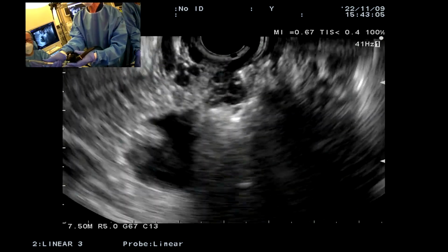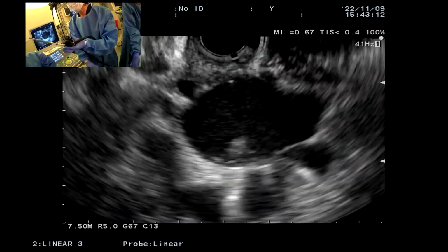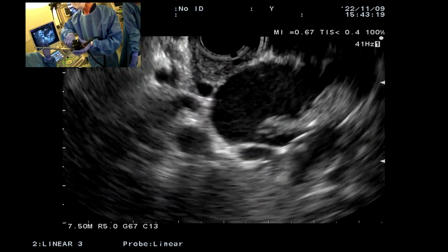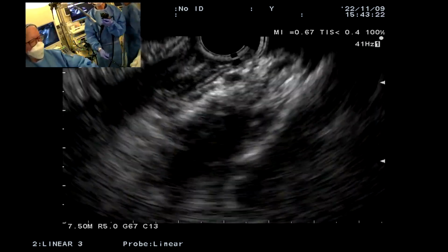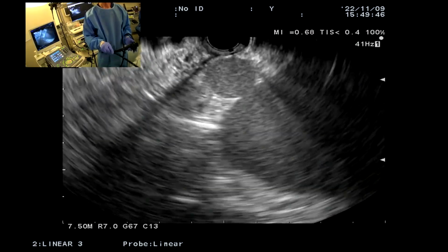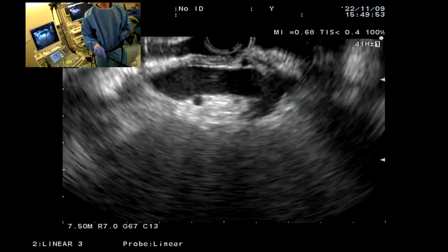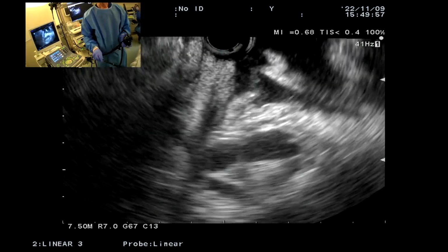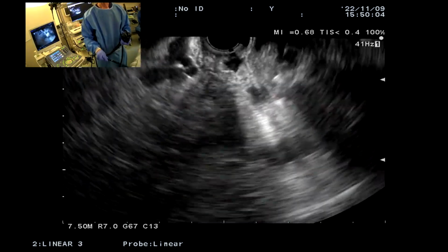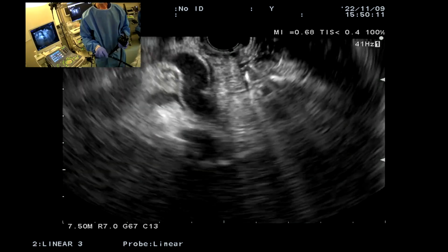And then the first thing I do is I'm going to advance the sheath forward like this into the lumen of the esophagus, and I've pulled back the needle, and just advanced this forward so that it's away from the tip of the scope, and I'm just going to pull this all the way out. All right, we're going to take a quick look after our injection, our coil glue treatment. A little accessory spleen there, and there's our spleen, splenic hilum, pull back towards the fundus, and so we know at the fundus when we see the spleen, and we have still some water here in the fundus. So already you see all this artifact shadowing. That's the glue and the coils.